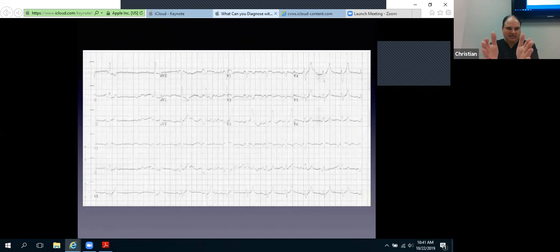If I take this EKG from another hospital, and I'm called in as an expert witness to look at it, my criticism isn't of the attending physician for not seeing that. So this is hyperkalemia. This patient has hyperkalemia, but during the arrest that's not picked up on because they're focused on the arrest and not doing a 12 lead. Oh, this was a 12 lead. I see what you're saying. The patient got a 12 lead in the trauma room. Yeah, in the trauma room.